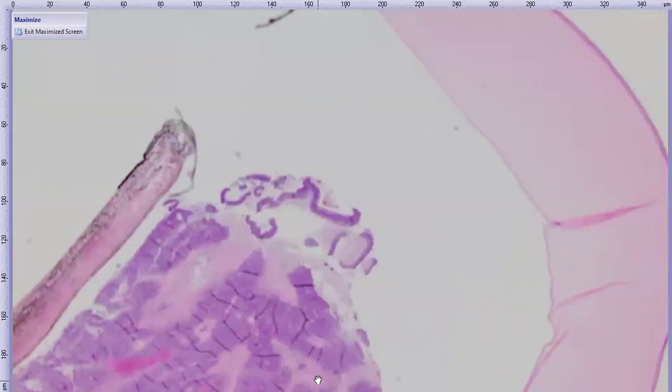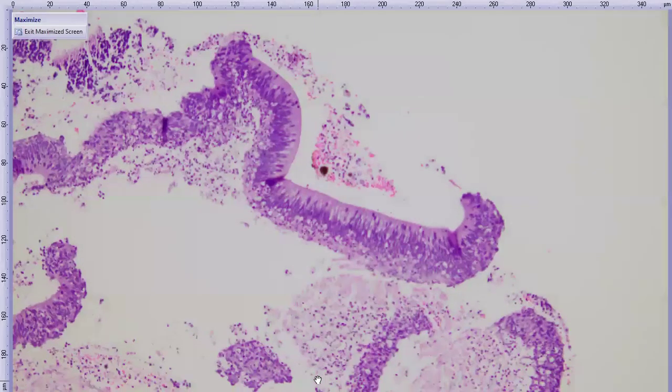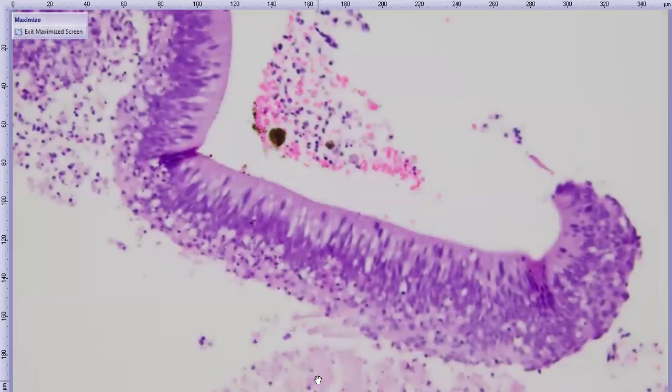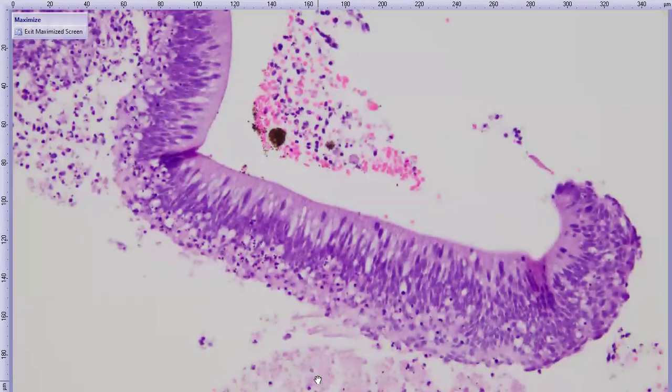There are very few reports of true retinoblastoma in animals, so I think it's exceedingly rare. But this one, you could make a case for it, except its primary location is not associated with the retina. But anyway, this is a really cool case. Really beautiful. Neat. Cool.